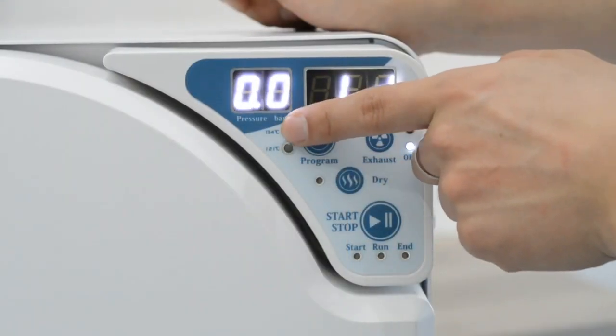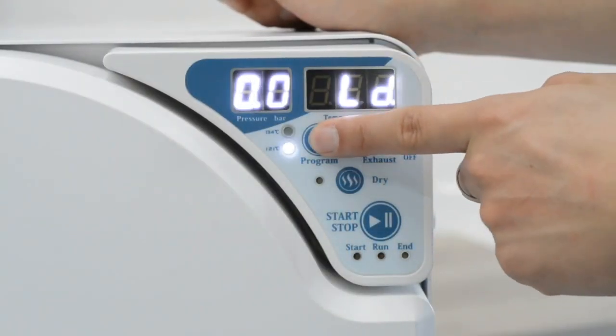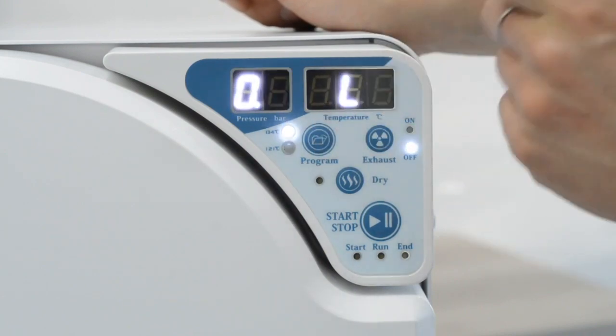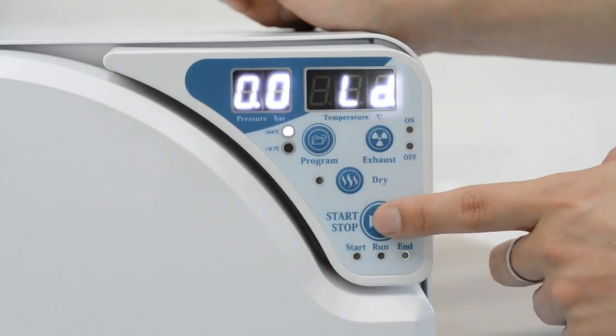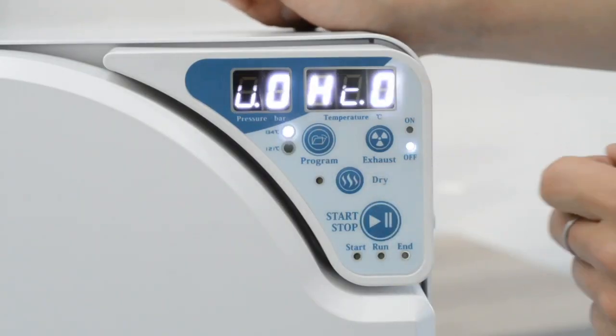Select 121 or 134 degrees temperature according to your instrument. Then we can press the start button to run the program.